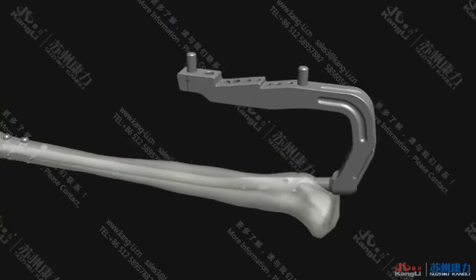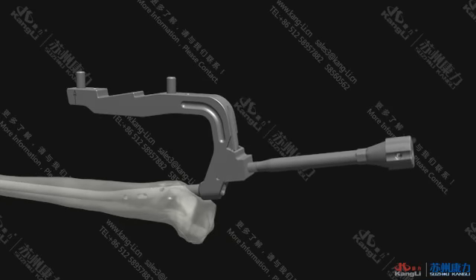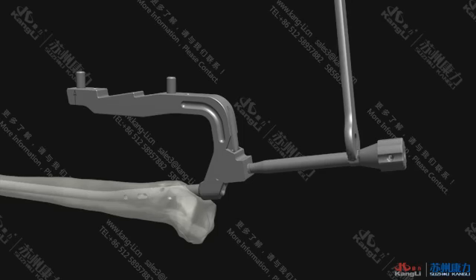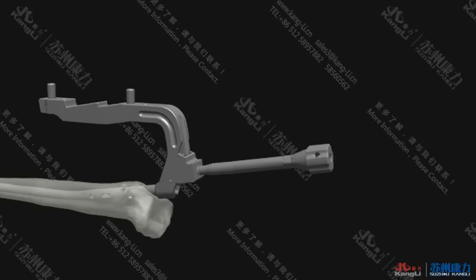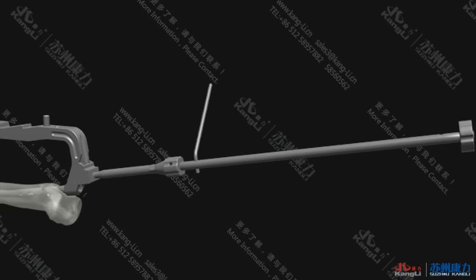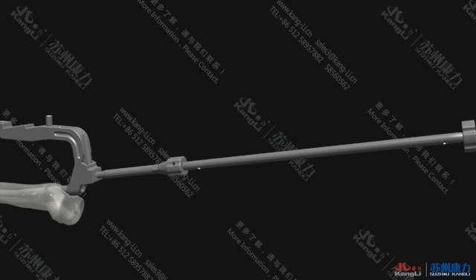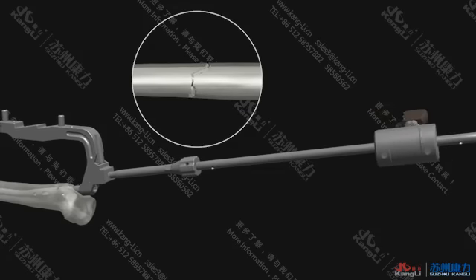Lock the locking screw at the distal end first. Install the nail leg connector on the groove of the holder, and then tighten it with an open-end wrench. Connect it with a slide hammer guide bar. Insert the slide hammer into the slide hammer guide bar and apply the force from the distal end to the proximal end.